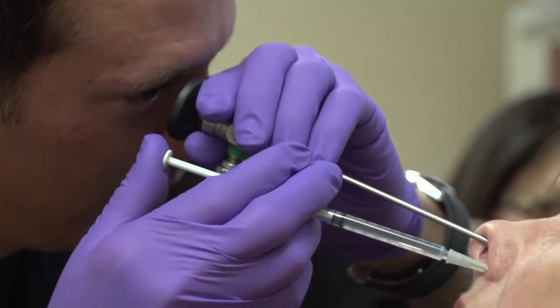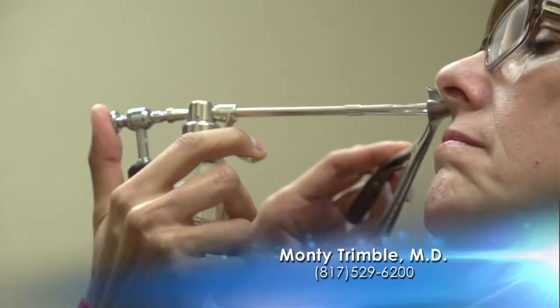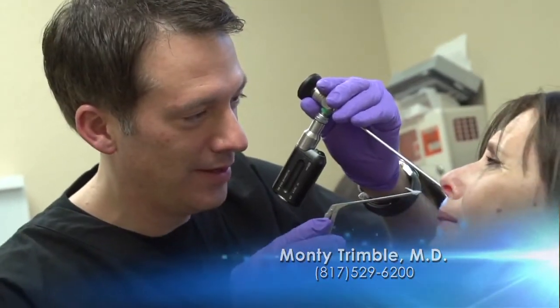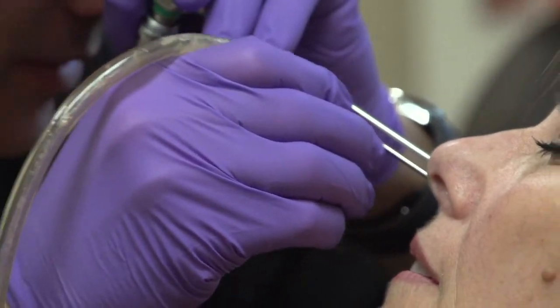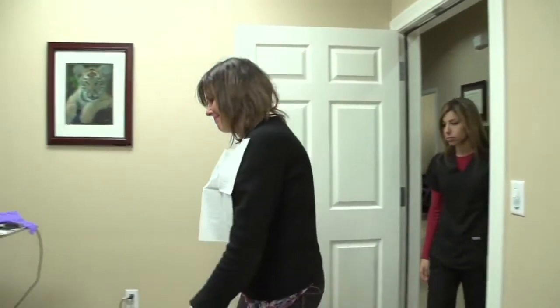You come into the examination room, we place you in the chair. The nose is then topically anesthetized and decongested, and that takes usually a couple of sprays over a period of about 20 minutes. And then I go in and place cotton balls soaked with topical anesthetic in the areas that we're going to be treating. There are some injections, but it's such a small amount of injection that most people never even feel the needle. After that, the patient's then transferred to the treatment room, then the procedure begins.